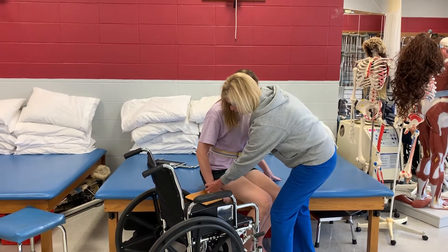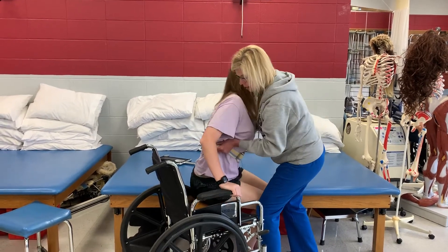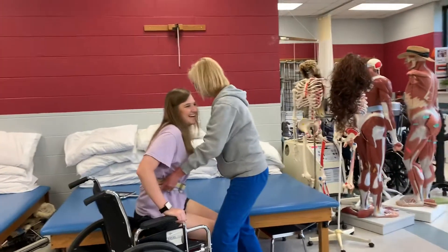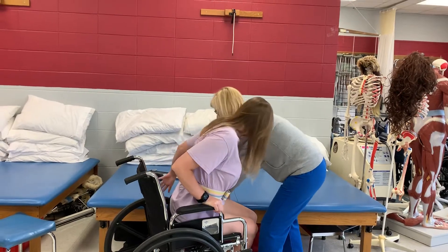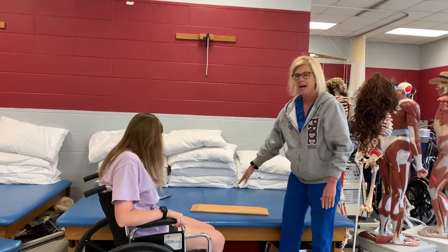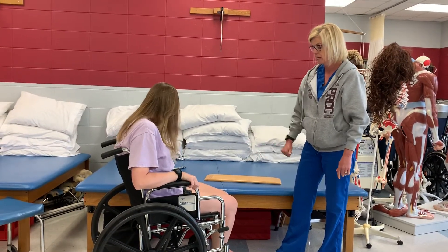As soon as she can, she can reach to the seat. She pushes and slides — she took the whole board with her and slides onto the wheelchair, and then you can take the board out. I could have put a towel or something, because she does have shorts on, and it would have slid just a little bit easier.